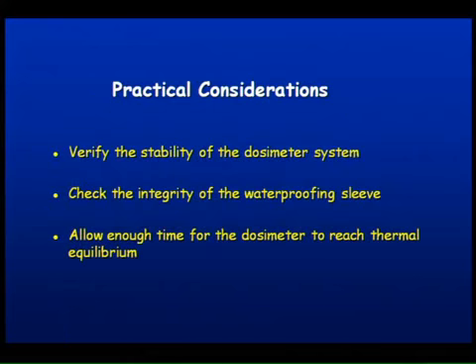Some practical considerations: make sure that you check the stability of the entire dosimeter system, check the integrity of the waterproofing sleeve, allow enough time for the dosimeter to reach thermal equilibrium with its surroundings.